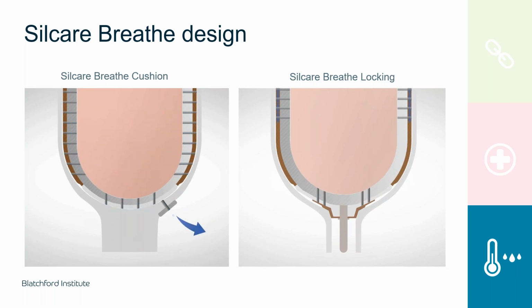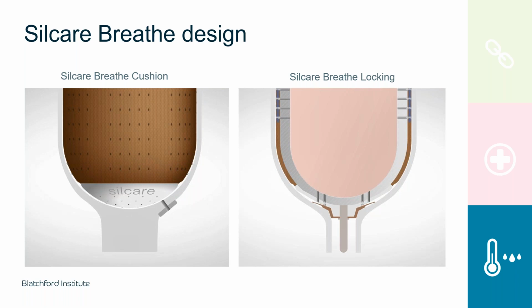On the animation on the right, you can see there's a kind of brown valve shape at the umbrella of the liner, just where the pin's coming through. And again, in loading, the valve opens, so air and moisture can be expelled, and then the valve closes during swing, so it means that air doesn't get back into the system.